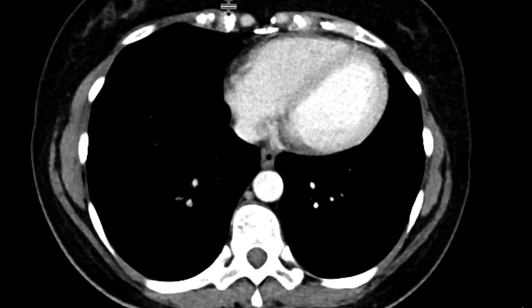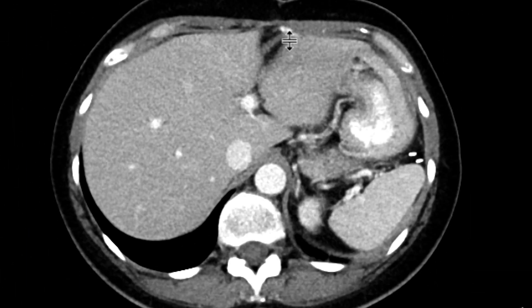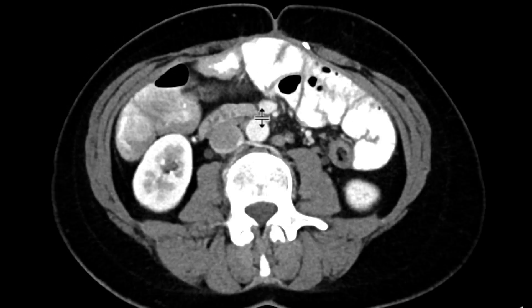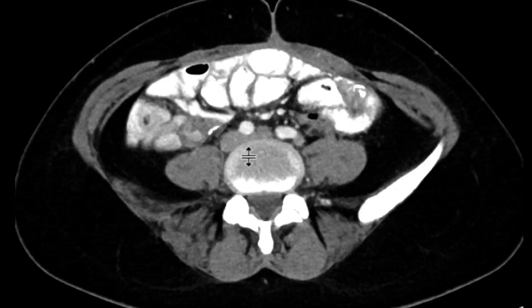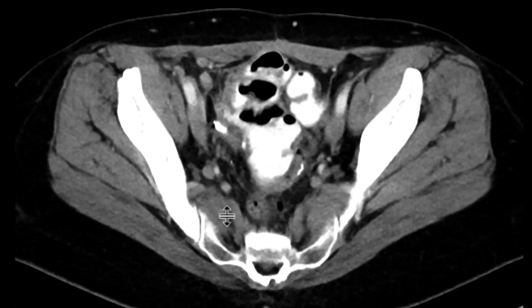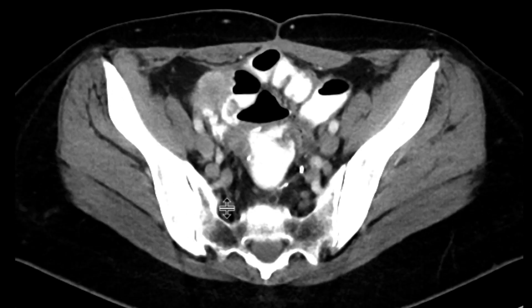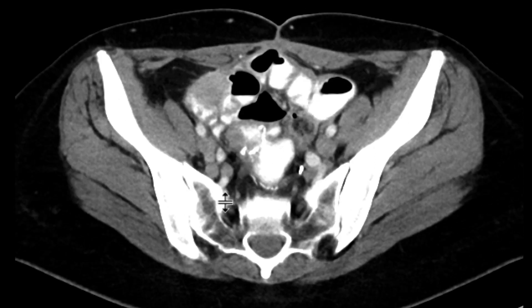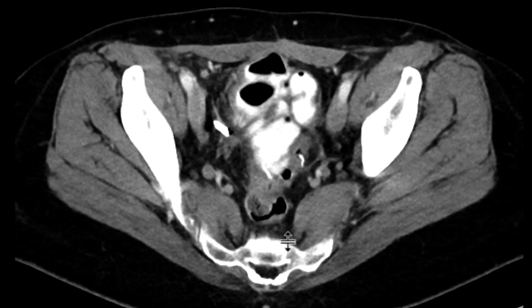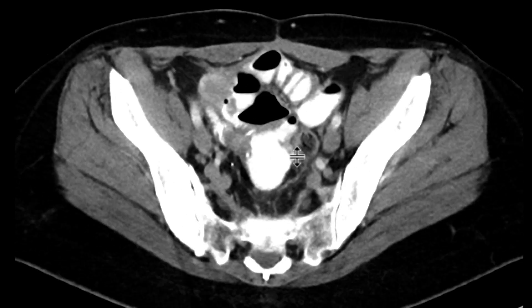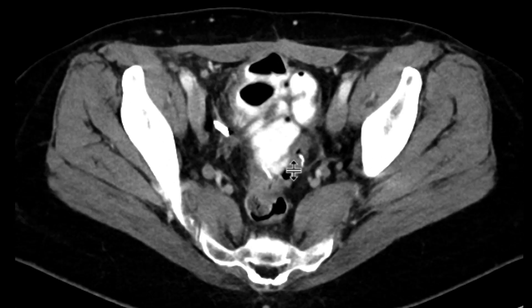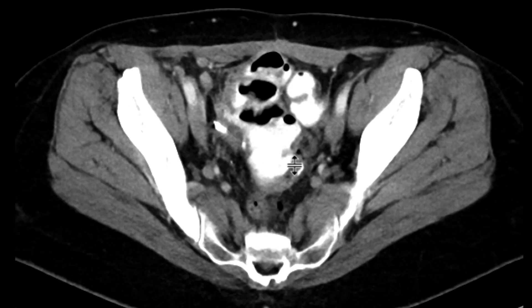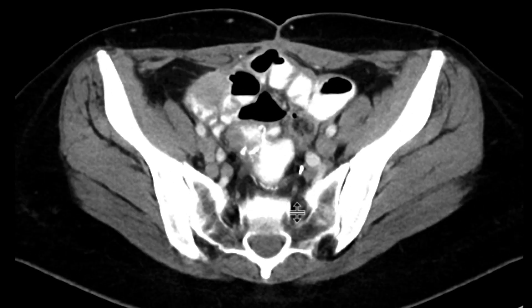The patient comes back for another restaging study, and this time we do give oral contrast. As we scroll downwards, we can see that right there in the pelvis there's an abnormality — it's sort of embedded and adjacent to all these loops of bowel. There's a soft tissue attenuation mass in the right lower quadrant. You can see that the round ligament adjacent to it is also thickened, and there's maybe a nodule deep to that rectus muscle.